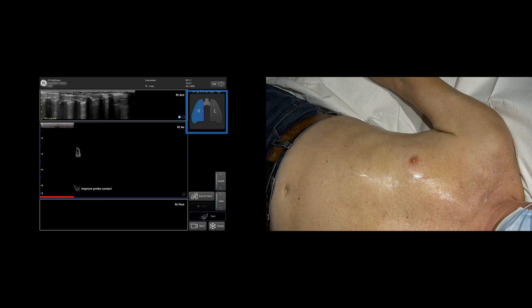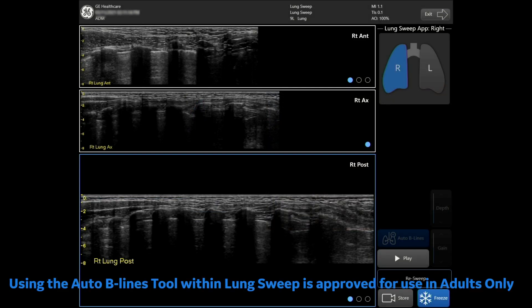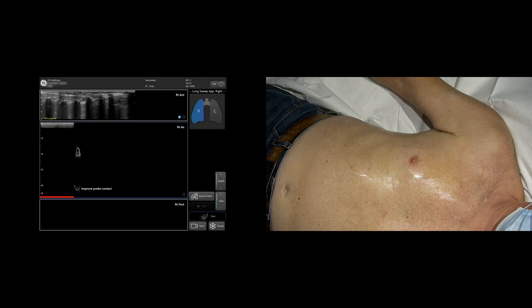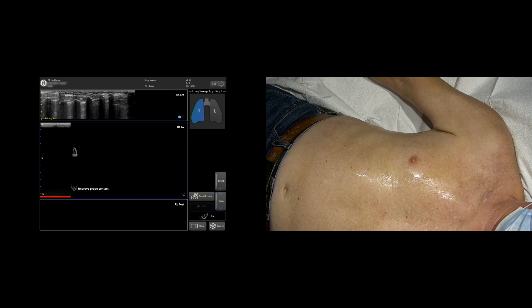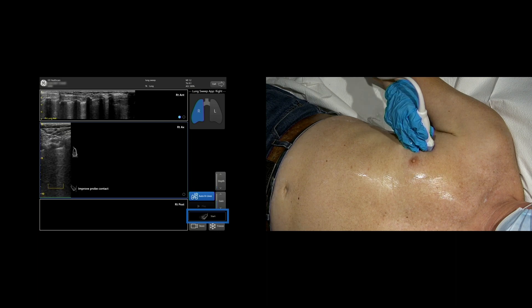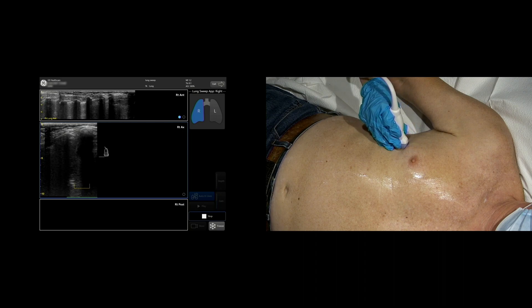B-lines can be assessed while using the Lung Sweep tool. Using the Auto-B Lines tool within Lung Sweep is approved for use in adults only. When used within Lung Sweep, B-Lines are highlighted over the entire panoramic view. Change the depth to 8 centimeters or more. Note: the Auto-B Lines tool cannot run while the depth is under 8 centimeters. Tap Auto-B Lines, place the probe on the patient, and tap Start. Or lift the probe, set it down again, and begin the sweep. Then sweep the probe.